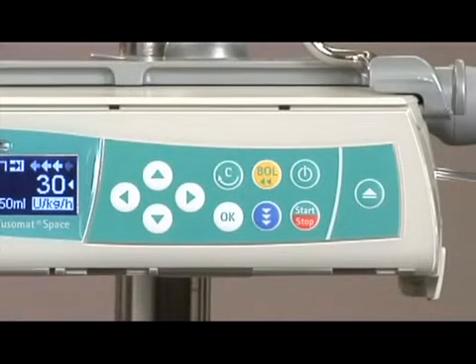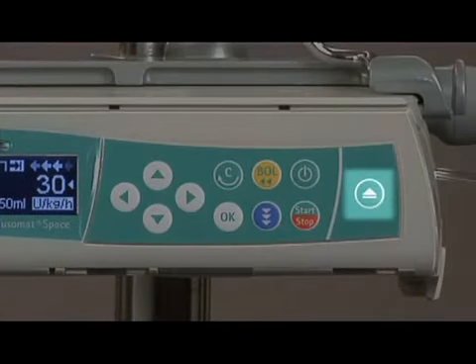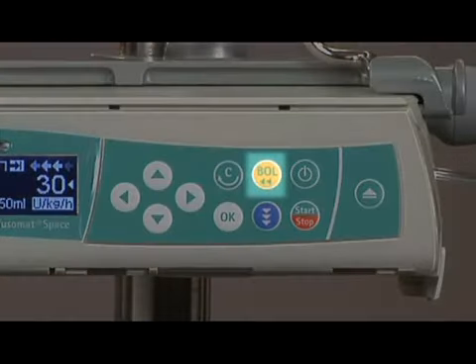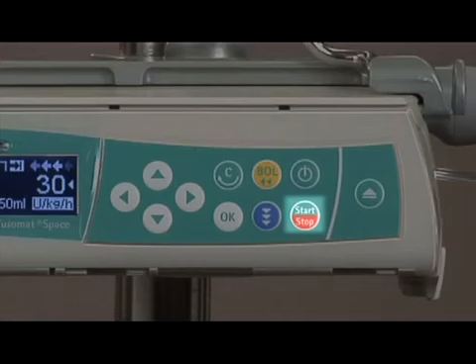Now we will review the keypad. Directional arrows help navigate through programming screens. All screen prompts will have a corresponding arrow. Door open key. Universal power key for powering on, off, and standby. BOL key to program a bolus. C key will clear data on programming screens and function as a back key. Start-stop key starts and stops infusions. Blue arrow key for biomedical and barcode scanning. OK key to confirm entries.